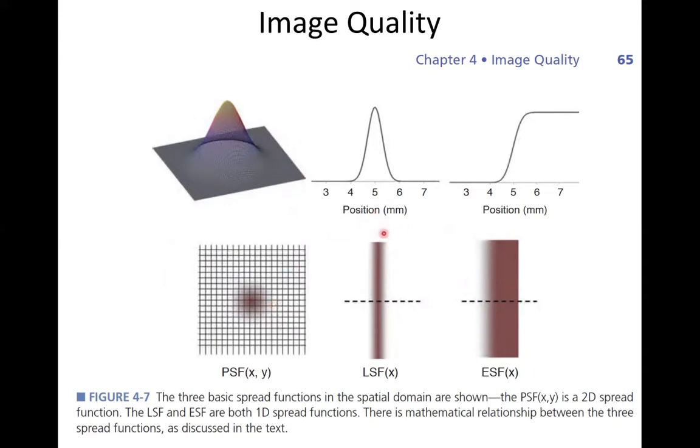If, for say an X-ray imaging system, I put on my imaging plane a very thin wire, I can get a line spread function. And what that does is it takes away the dependence in this direction. It's a constant signal in this direction. And so when I'm only evaluating my spatial resolution in one dimension, it's along this line, since it doesn't vary in this direction.